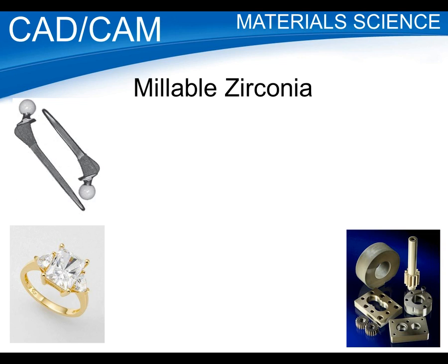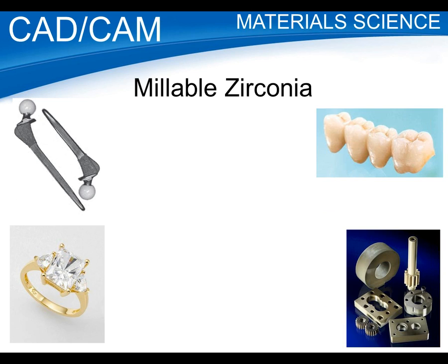Professionally, I became aware of zirconia in my past life, when I worked for a firm that made investment castings for aerospace. About 10% of their business was medical devices, and they made the hips and knees, etc. We would make the metal component, and then it would be sent out to have the zirconia plated on the surface. Early on, there were some real learnings related to using zirconia in biomedical. We'll talk about that a little more later. And this, of course, is what we're all interested in: zirconia to make teeth. So we see here a 4-unit bridge.